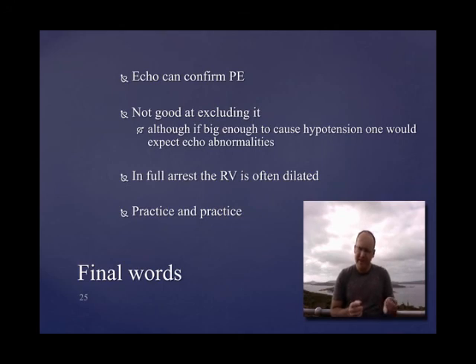And finally, like all of ultrasound, it all comes down to practice. So please, spend hours and hours practicing. Every patient with chest pain, have a look. It's important that they understand that this is practice. It's not a proper echo. You're just looking for a few things, and it's for your training. But when you get that hypotensive peri-arrest patient, it will make a huge difference. And in fact, this has revolutionized all of our practice, as you've more than realized by now. That's it. Let's get to scanning.